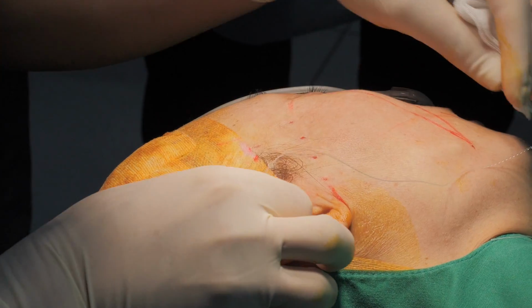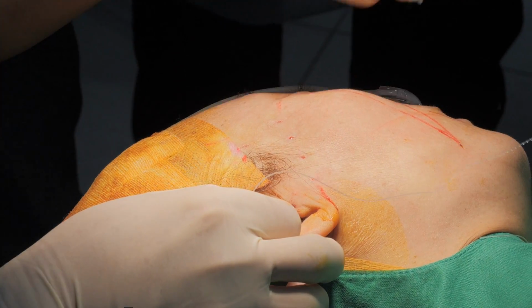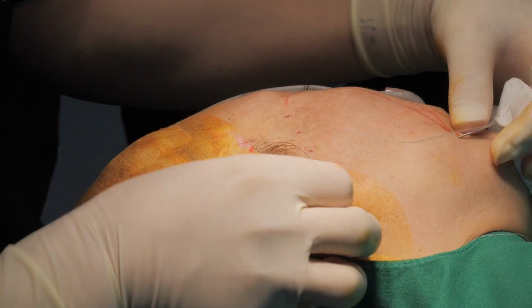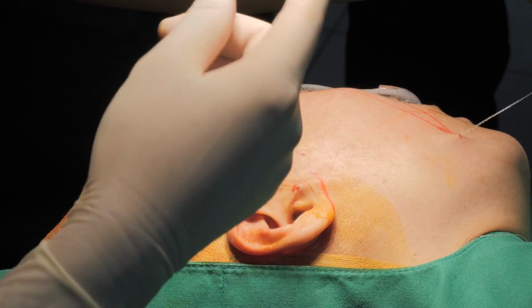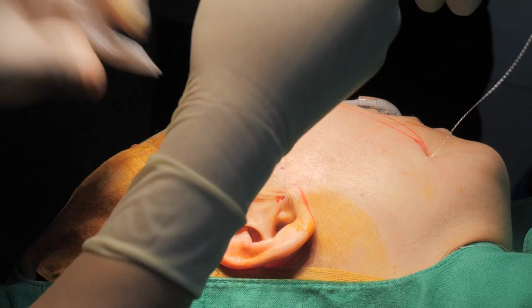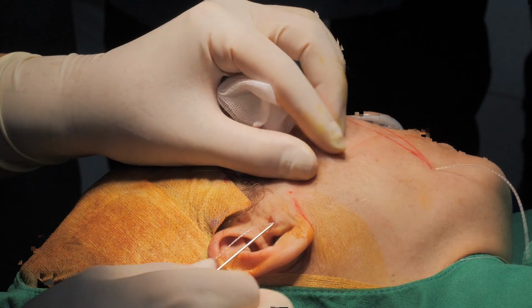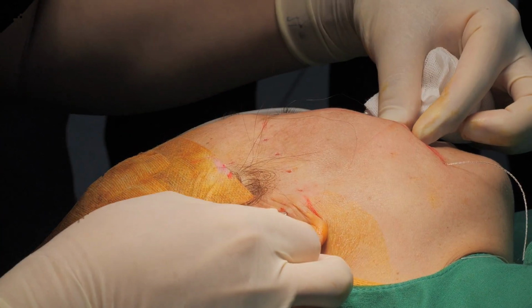I insert. Okay. 1. Insert one more thread. 2.